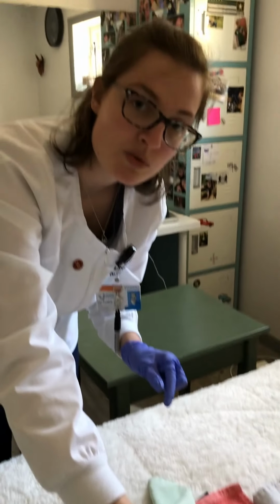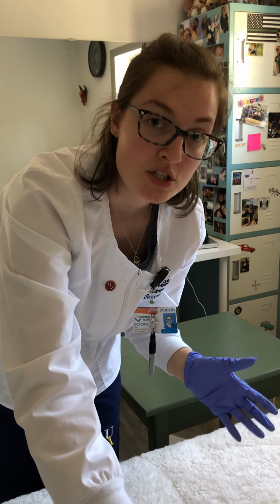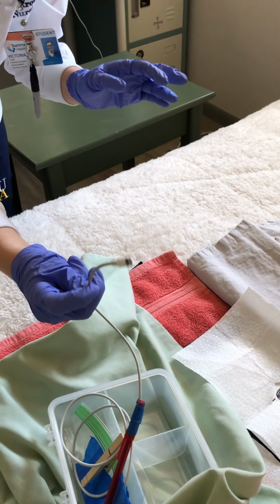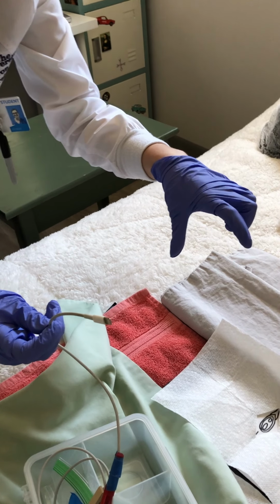For female patients, we want to lubricate the tip of the catheter about 1 to 2 inches. The lubrication is just to make it easier to pass through the urethra. Okay, so we want to hold it just like this. I'm going to take my non-dominant hand and spread the labial folds.